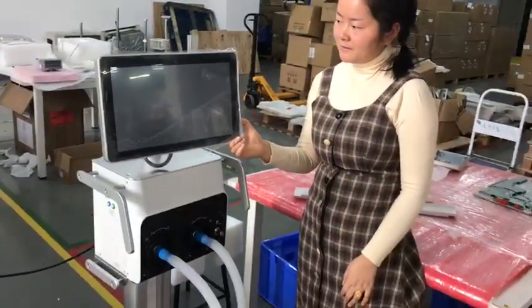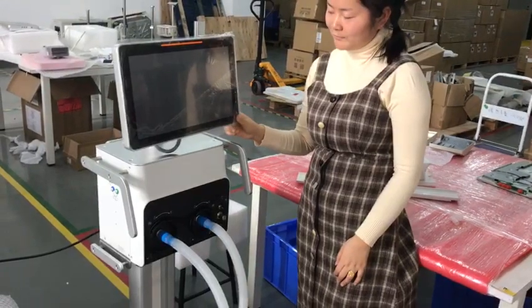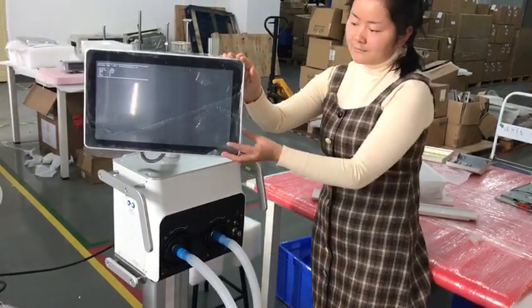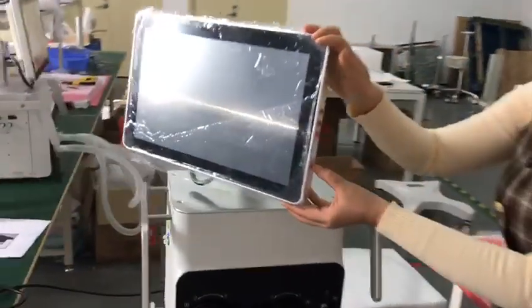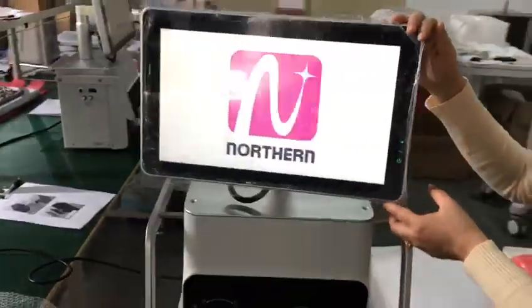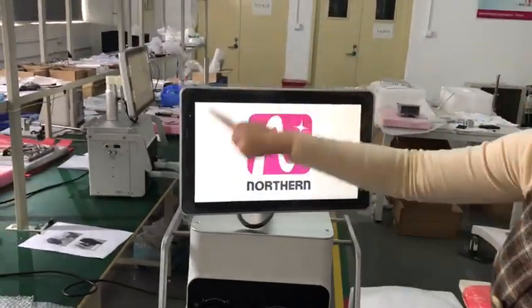Let me turn on the machine. This is the button for turn on and turn off. Our logo.